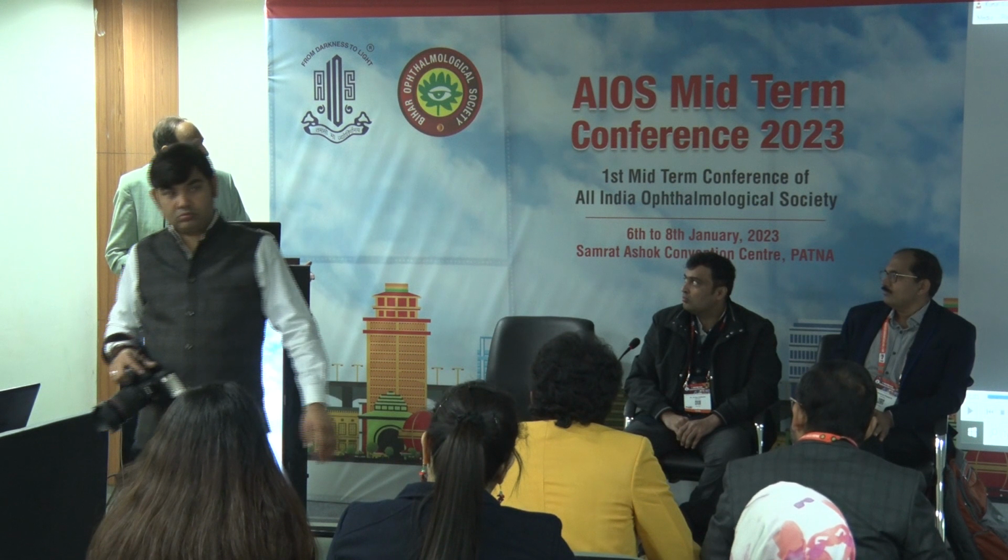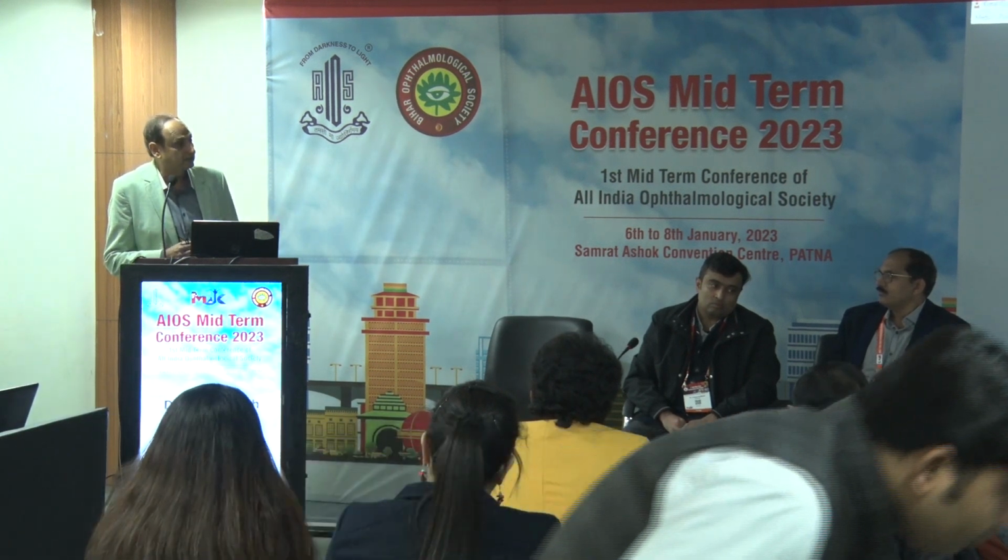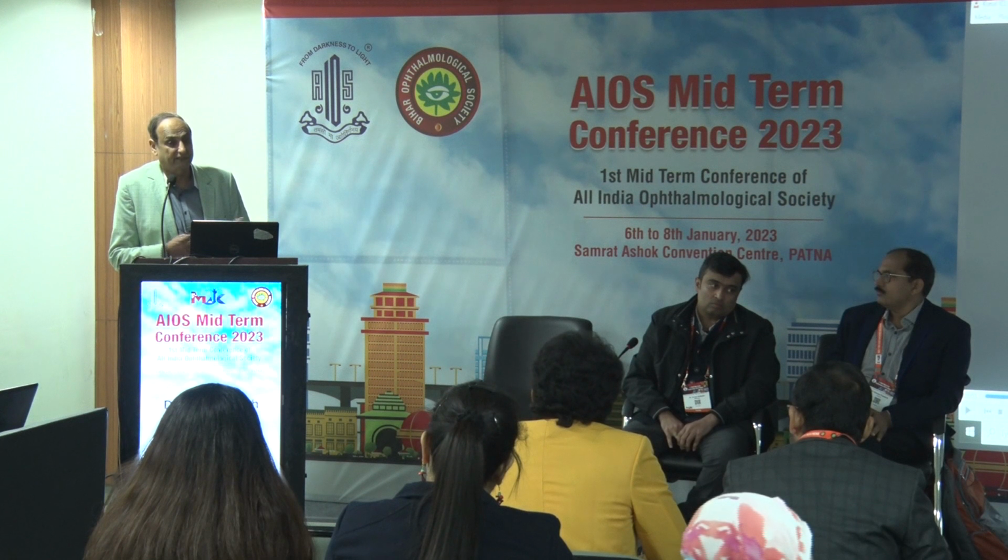In such a patient, whatever your sizing may be, these patients tend to develop problems. I saw a friend's patient, both eyes implanted, and UBM was done, and then we found out it was plateau iris, a very peculiar configuration of the iris insertion which led to this. Otherwise, the sizing and everything was good. So there are always some exceptions. They have a very bulky ciliary body.